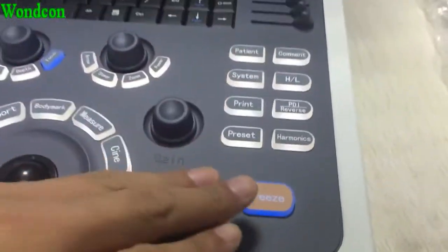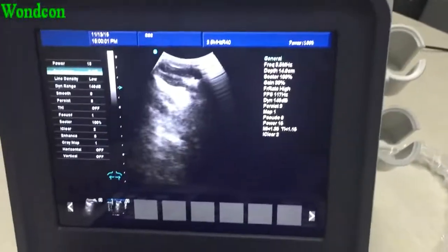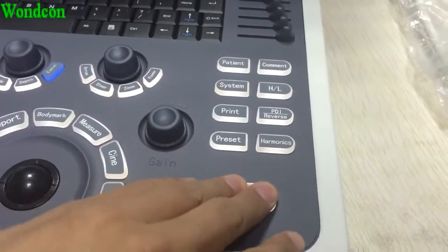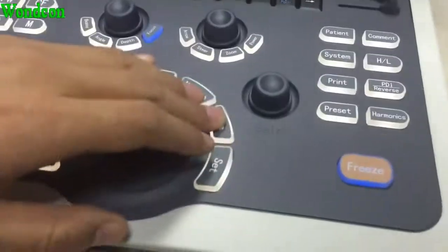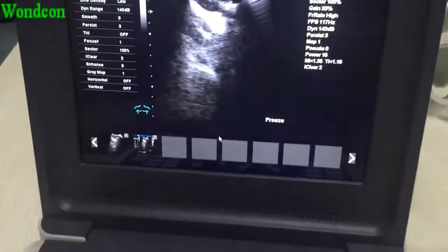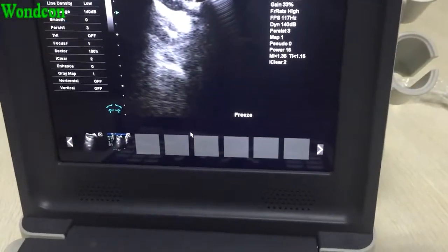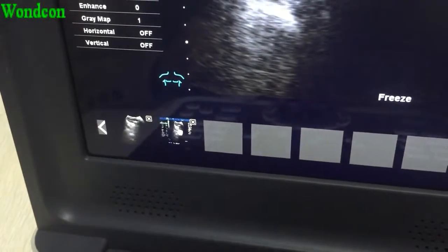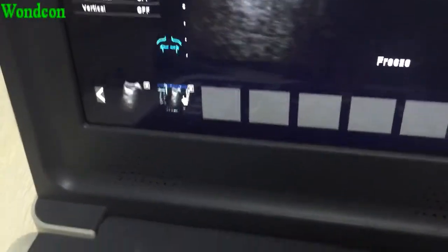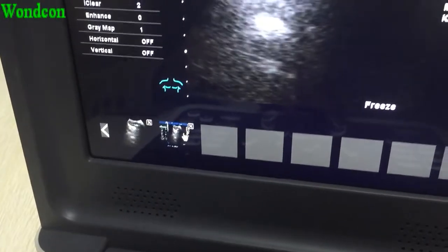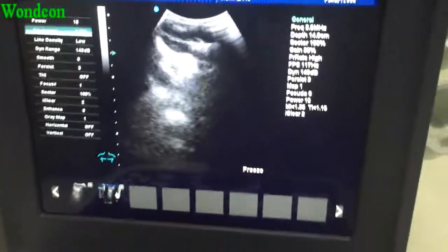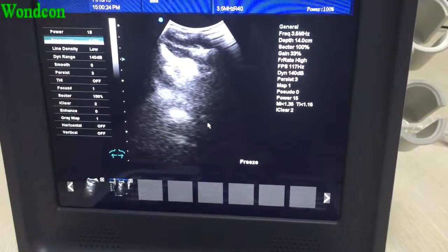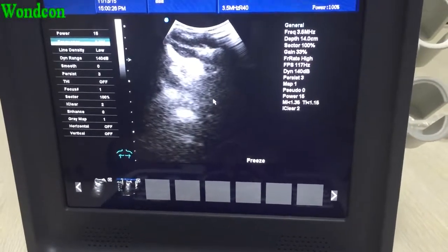If you want to record the image and the value, press and assign. You will find the images at the bottom of the screen. Press it to view the stored image.